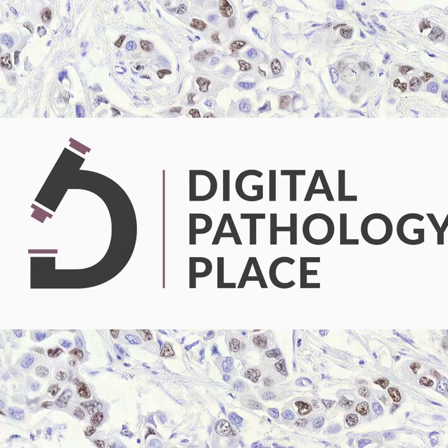However, there are several image analysis algorithms that have received approval or clearance from regulatory bodies like the US FDA or European EMA. These algorithms are applied in regulated environments, such as hospitals and clinics in both the United States and Europe. Specifically designed to assist in medical decision-making processes, these algorithms undergo rigorous testing and verification procedures under the strict guidelines of these regulatory bodies to ensure their accuracy and reliability.